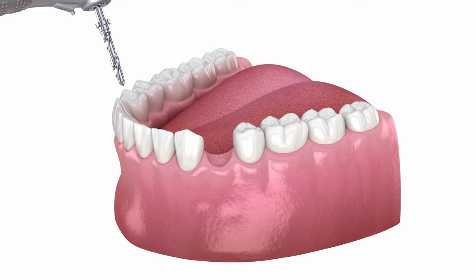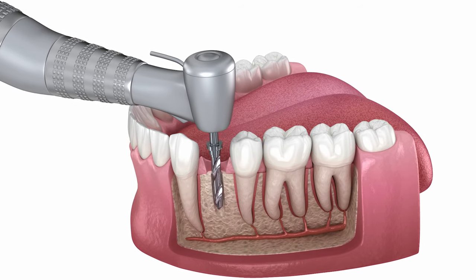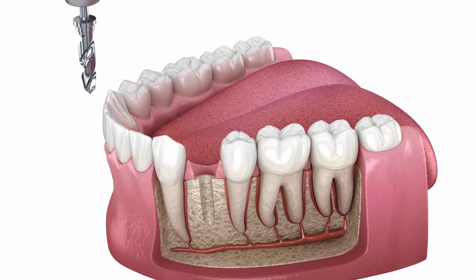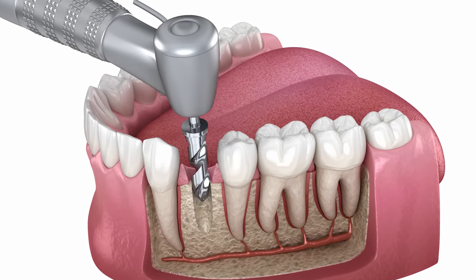Now that you're numb, we're going to take our drill and begin creating the space for the implant by removing bone, like you can see in this video here. We're then going to do the same thing but with a slightly wider drill and go a little bit longer to the length of the implant that we need.